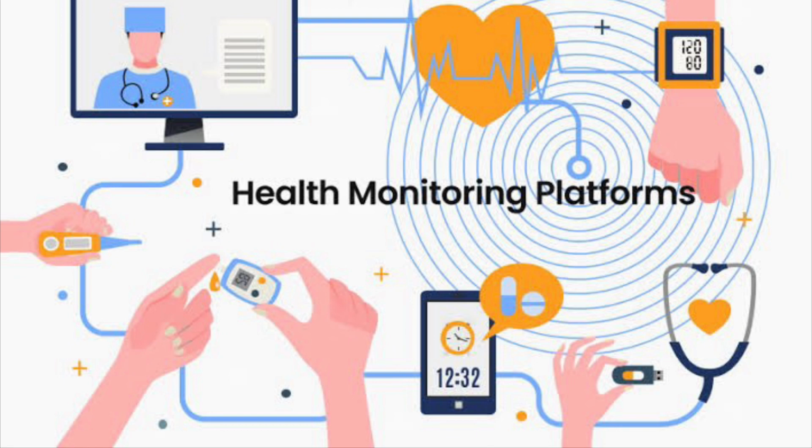In an ideal scenario, the monitoring data should be reviewed in a hospital command center, which is becoming popular. It's like a NASA space station control room, where a lot of people sit, but more importantly, a lot of monitors show all these, and artificial intelligence and machine learning algorithms will read this and give alarms accordingly. So this is monitored in person by people who are qualified to do that, and actions are taken appropriately. So this is one of the crucial steps: what you do with the data, what software is to be used, what technology is to be used, what the manpower is, and what the location is where this is going to be monitored.